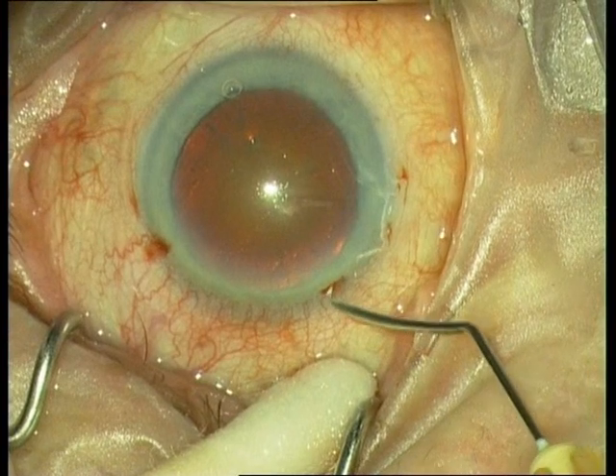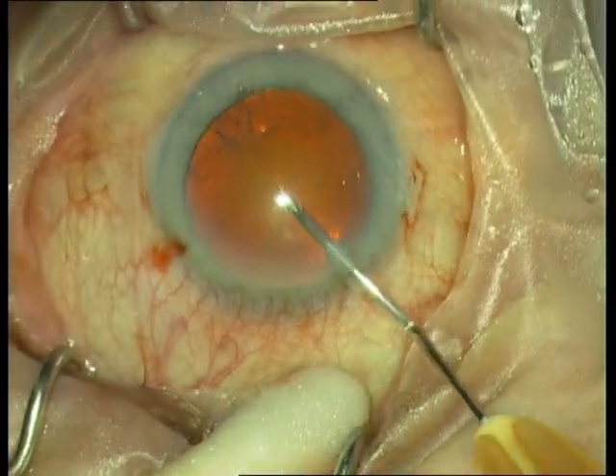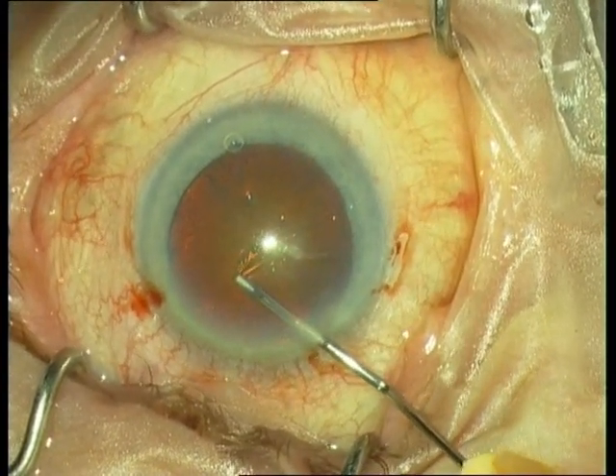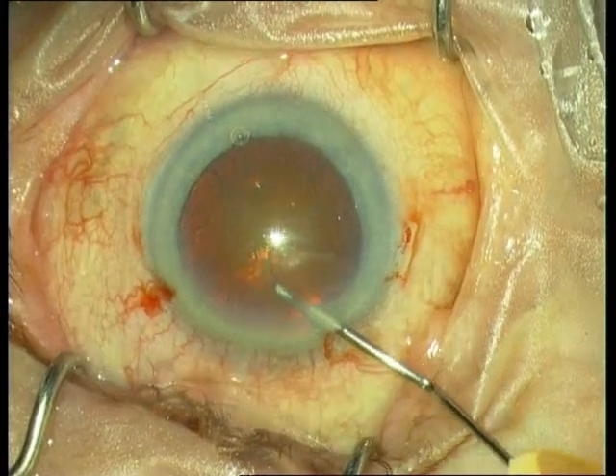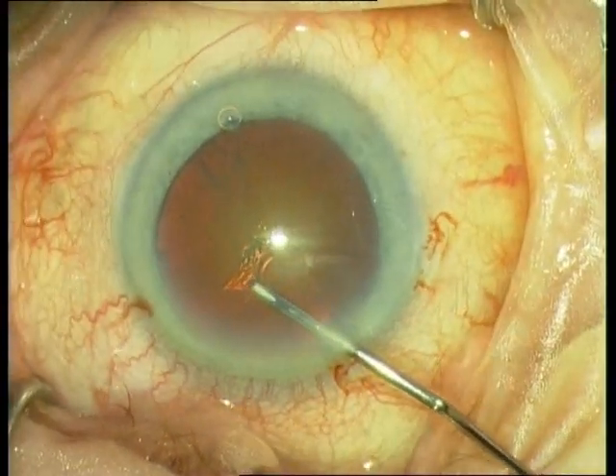Next is the rhexis. I use here the cystotome, which is a bent needle. Pinch the anterior capsule, move the needle to the periphery, and then create a flap.